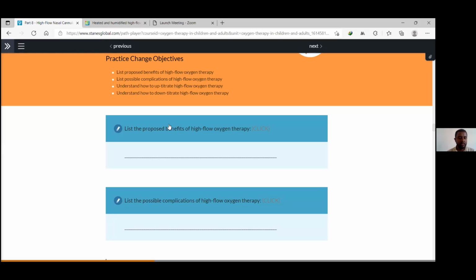Okay, generally, there are very few risks associated with high flow oxygen therapy. Occasionally, the nasal prong may become blocked if there is a lot of mucus. Okay, thank you. Stefano said oxygen toxicity.